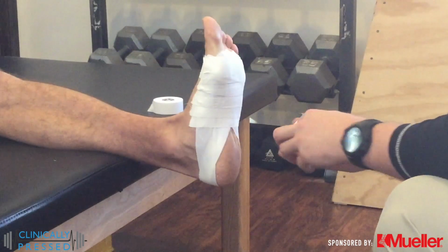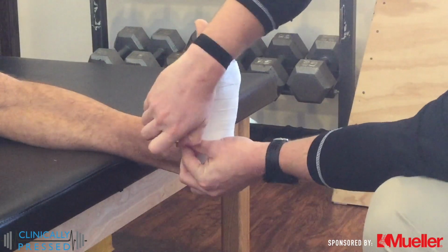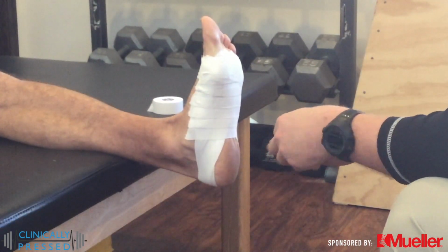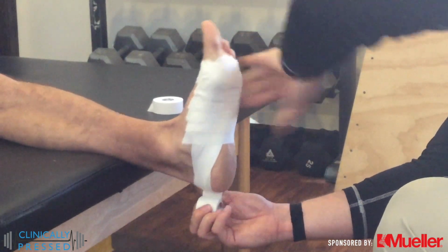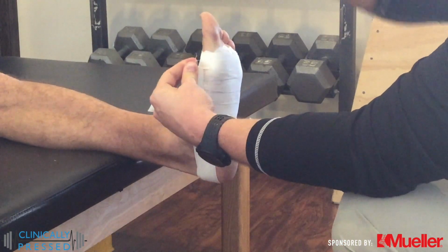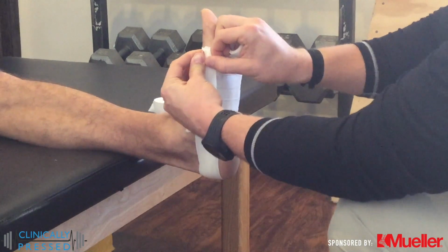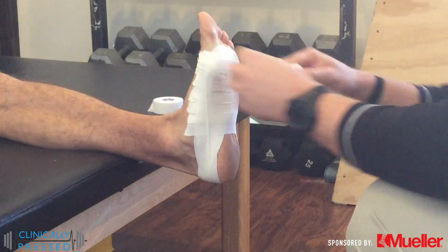This is something you'll have to play with your patient to see what is comfortable, as you don't want to make it overly tense, which can then tax the system. Then we'll put another closure strip on to hold all of those in place by wrapping around the back of the heel, or lateral to medial in this case. And then we'll also do a closure strip around the forefoot to make sure it stays.